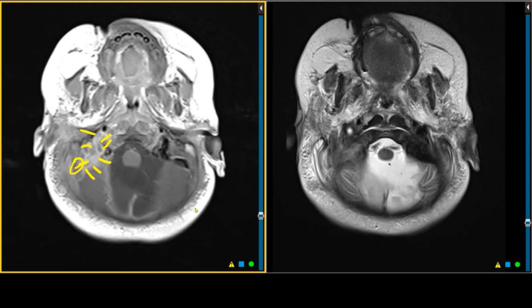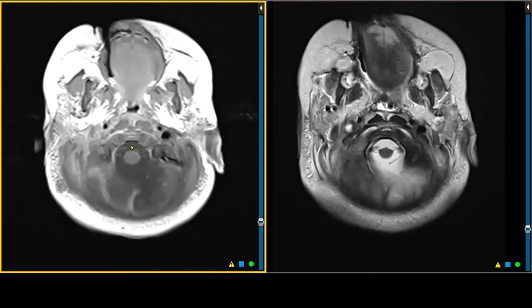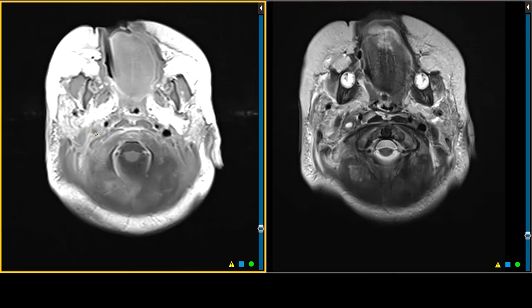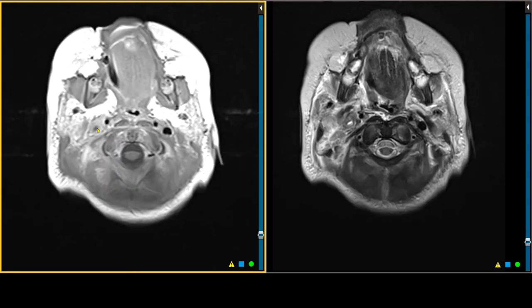This represents the thrombus, which is going from the sigmoid sinus into the jugular vein at the skull base. As we continue to scroll down, we can see the jugular vein absence of a flow void. Here's the normal jugular vein and internal carotid artery on the left. On the right, here's the internal carotid artery and the jugular vein, and there is enhancing tissue within the carotid sheath associated with the thrombosed vessel.